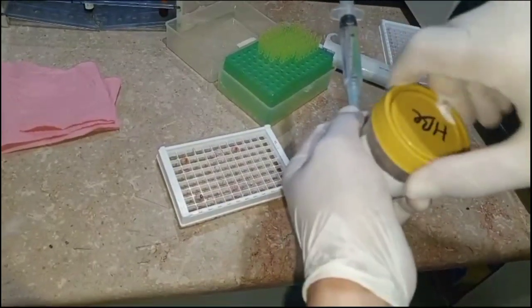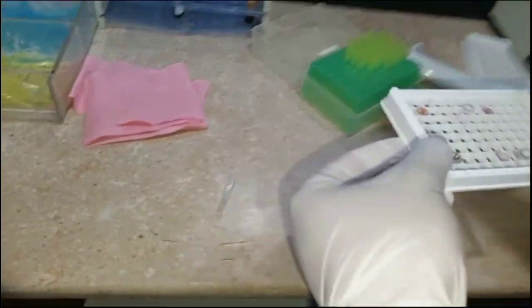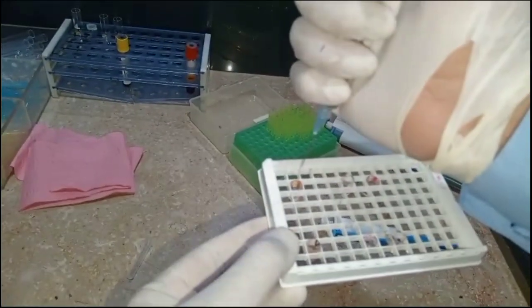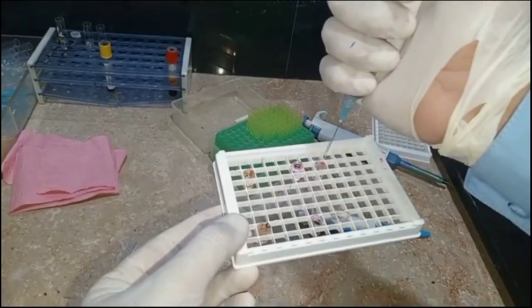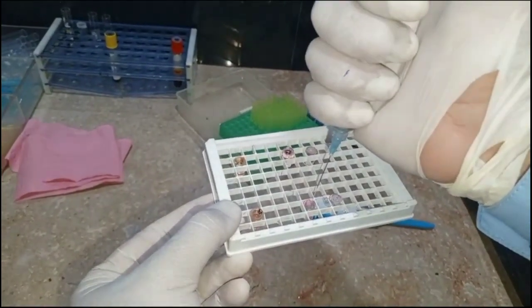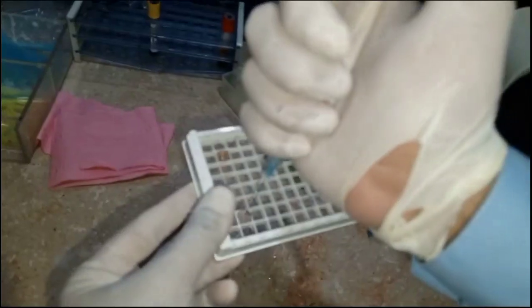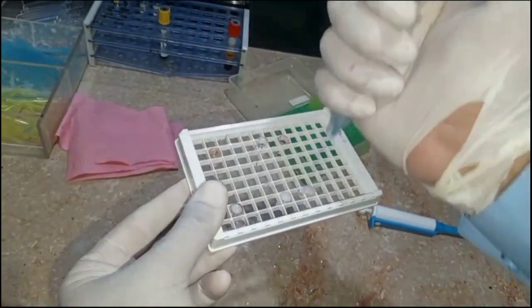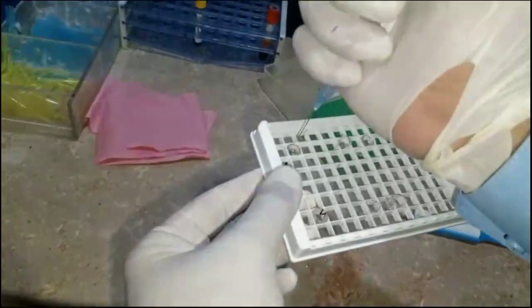Once we take the wash buffer that we already made, we fill the wells with it. First of all, we should discard the liquid which we added earlier, and then we add the wash buffer. As you can see, we mix it a little bit and then we discard it. We should wash all these wells 5 times. So the washing process will be 5 times.